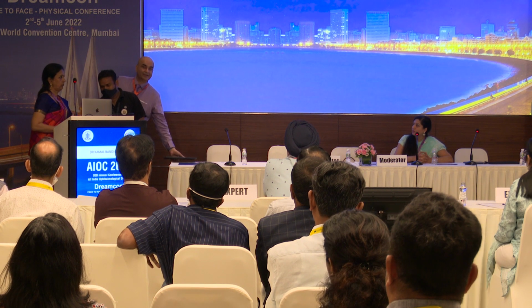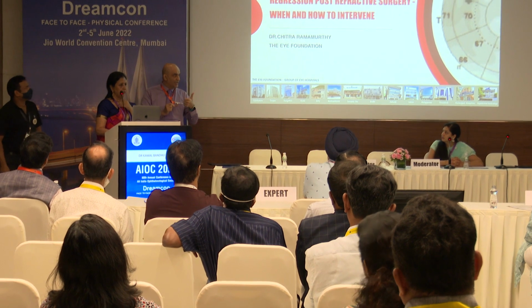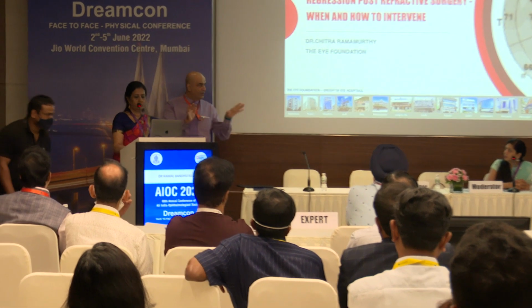What are the factors that you think would cause a rotation in the ICL or the IPCL? Very interesting case. I was just discussing this yesterday. I had a similar session. Normally, it's a bad measure. Most of the people are using automated measures on an infrared camera, because most of the equipment we use is automated. We just corroborate it with a caliper. So recheck it manually in edit mode, on any equipment you're using.